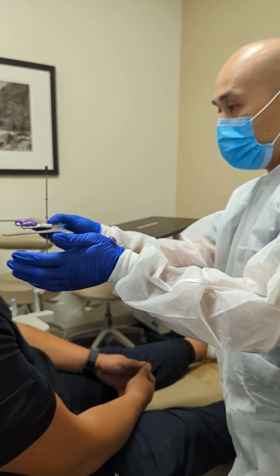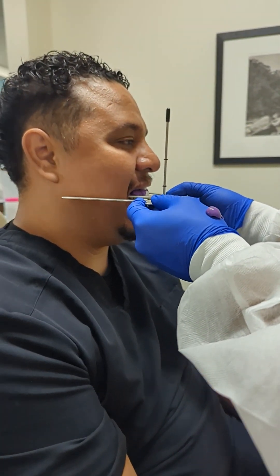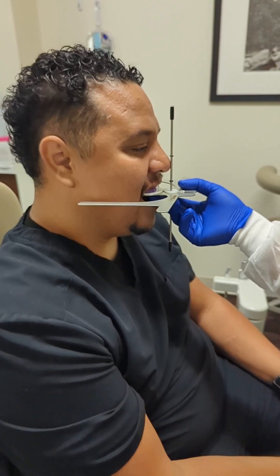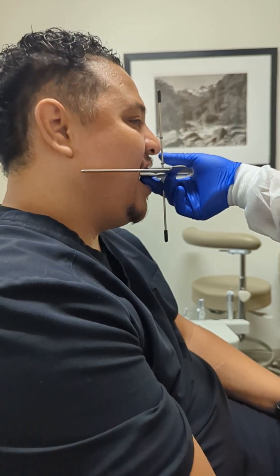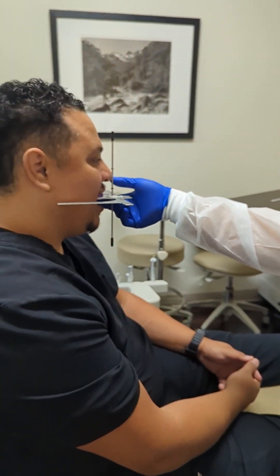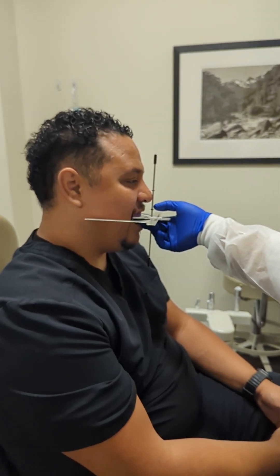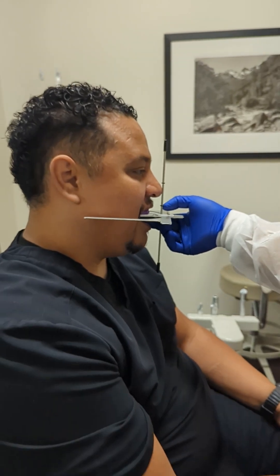From here, have the patient open. The first thing I'll focus in on is getting the incisal edge up against the plate here so it comes into contact. And I'm going to look at the vertical rod, make sure that's centered to the facial midline, and then kind of lean over to the side to see that the plane is parallel to the Frankfurt horizontal with him in a normal resting head posture. We let this set for about a minute and a half, and then we can remove this from the mouth.